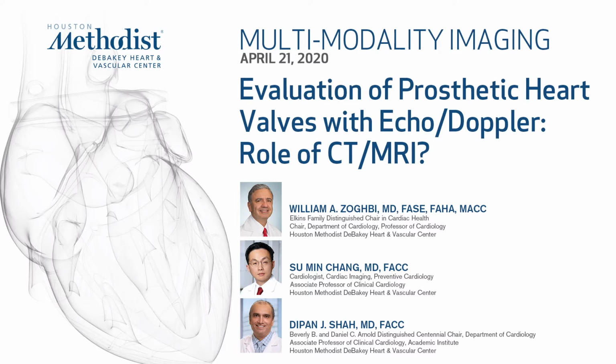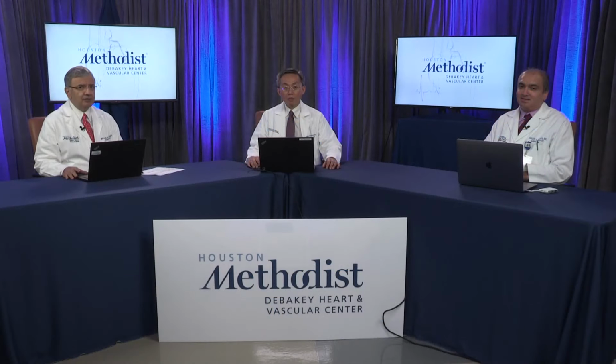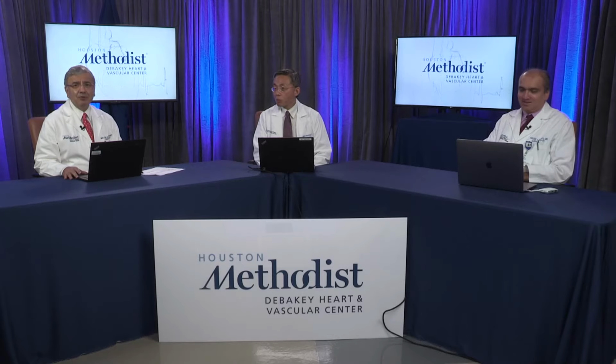I'm the chair of cardiology here, and it's a pleasure to welcome you to our multimodality imaging conference. With me today is Dr. Chang, Associate Director of Cardiac CT, and Dr. Dipan Shah, Director of Cardiovascular Imaging here, as well as Cardiac MRI. I think today we're going to have a great topic, bringing all the expertise in imaging to evaluate a difficult disease, prosthetic valves, and how to evaluate function and regurgitation. It's a big topic, and we'll try to squeeze it within a 1 hour timeline, and we welcome your questions.